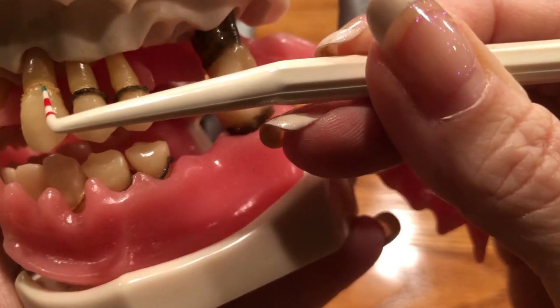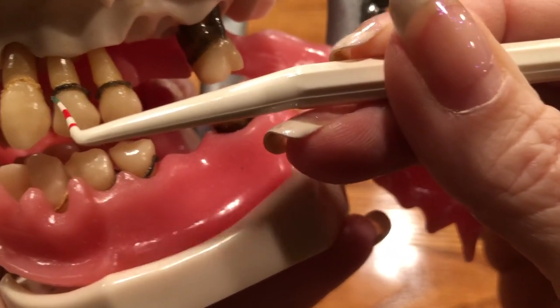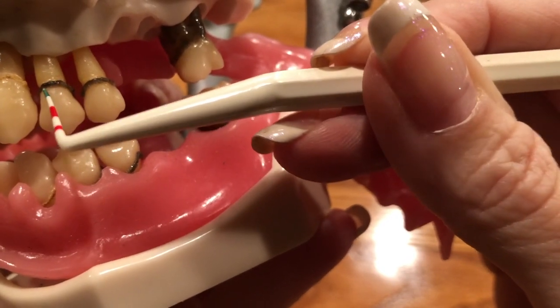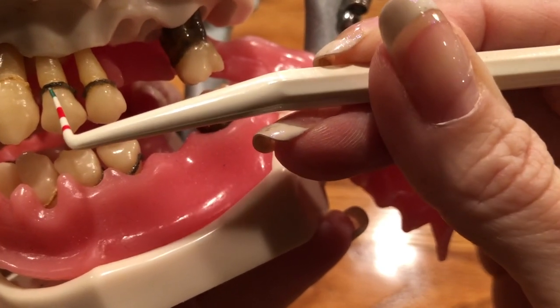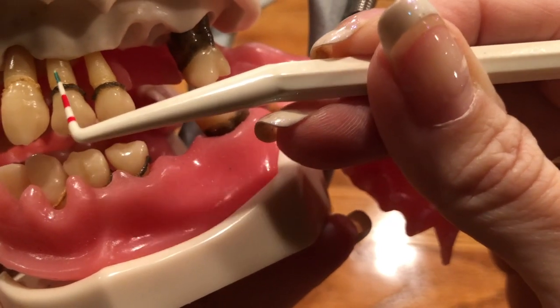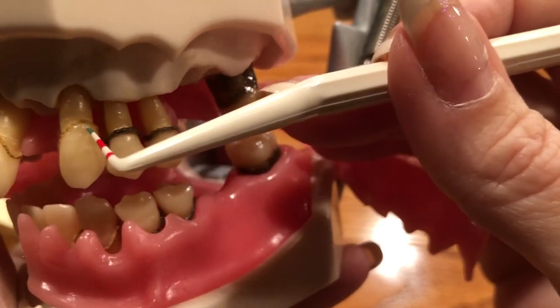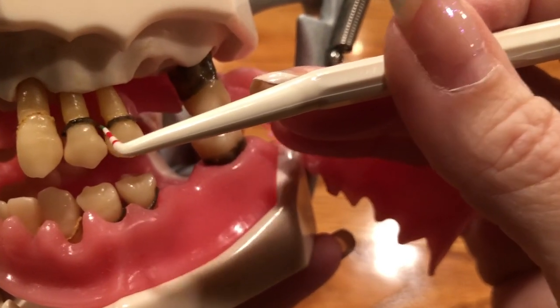Sometimes when you're probing, your probe actually stops here on the tartar and doesn't go down below the gum line. So sometimes you have to move your probe around this tartar, or you have to get the tartar off and then reprobe. So I could be getting a false 1 millimeter reading here because my probe is stopping on this and I'm not getting around the tooth and down to here where it's actually a 6 millimeter pocket, you can see. This is why it's important to get your teeth clean, because you want to get this plaque and calculus off before it's been there so long it turns dark.